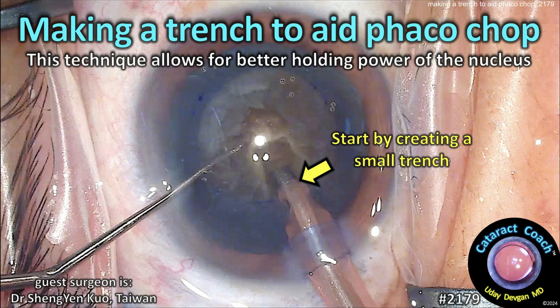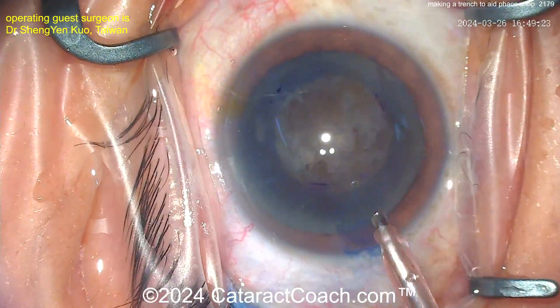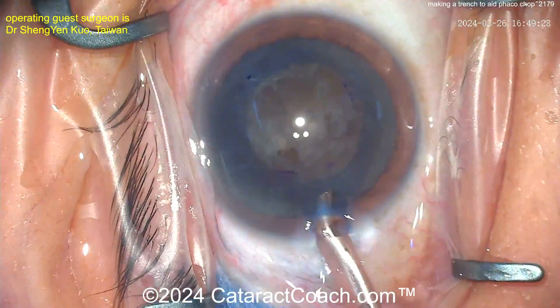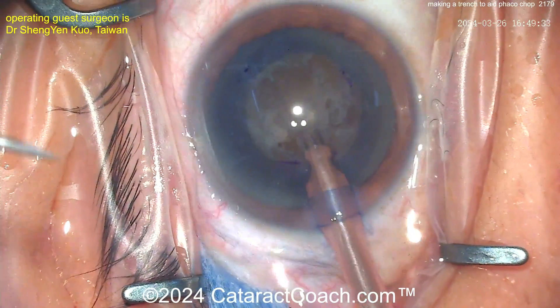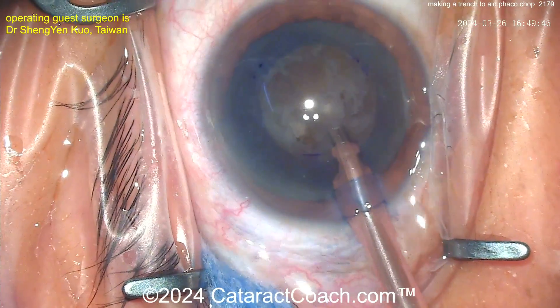CataractCoach.com — making a trench to aid phaco chop. This technique allows for better holding power of the nucleus. You can see it's a pretty dense cataract; there's a nice-looking incision. The phaco probe comes in and step one is to make a bit of a trench here.